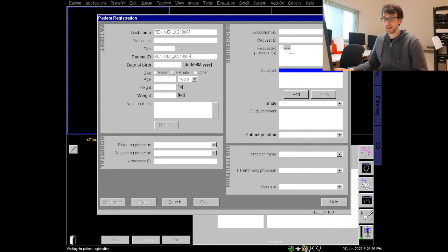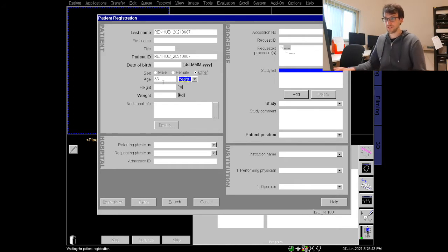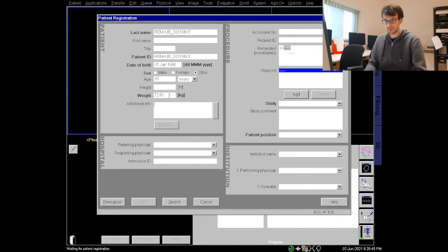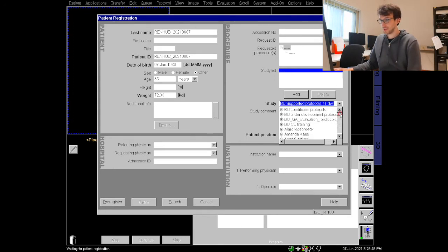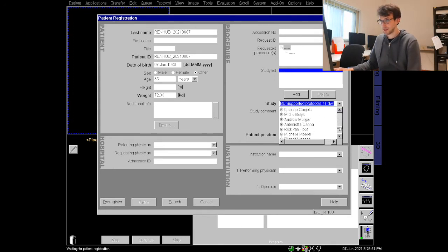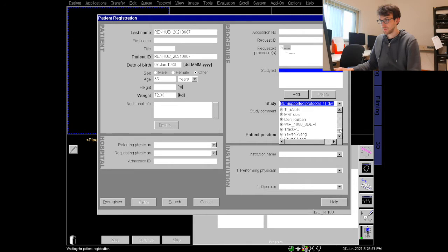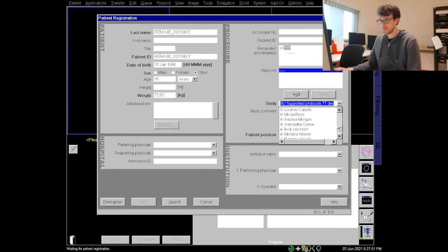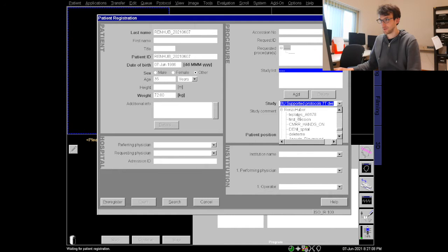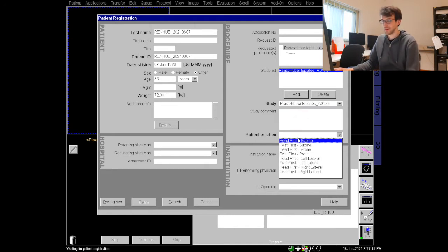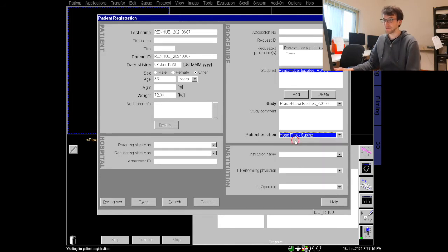We would have phantom in there right now. Let's say it's 35 years old, the weight is 72 and we can select a study. I would have a study prepared, for example my study, it's just somewhere down there. I do not find it quick so let's find it slowly. There we are, Renzo Huber. We can use anything from the templates and as always with head imaging at the 7Tesla we use head first supine.